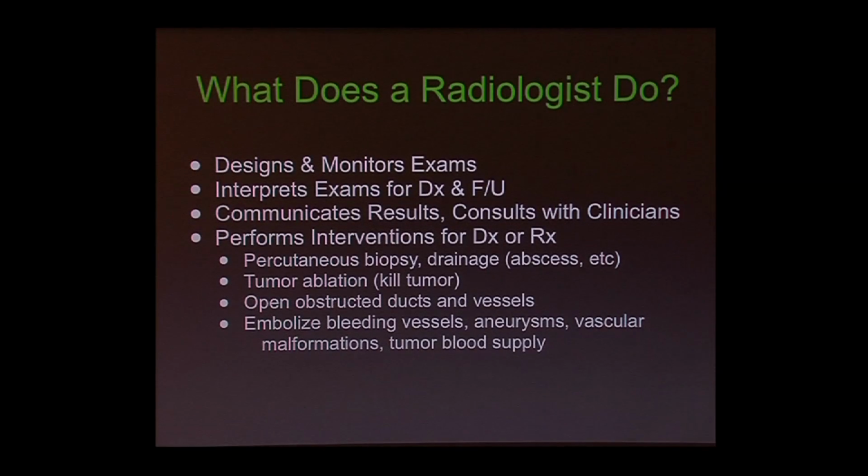We can do it with a needle percutaneously, using imaging to guide, and I'll talk about this in more detail, to avoid the structures we don't want to hit with that needle or probe or catheter, and getting right to the area of concern in the safest way possible without having to open the patient. Or we can even treat patients' problems, whether they be tumors or bleeds or whatever. So we'll talk about that in some detail.